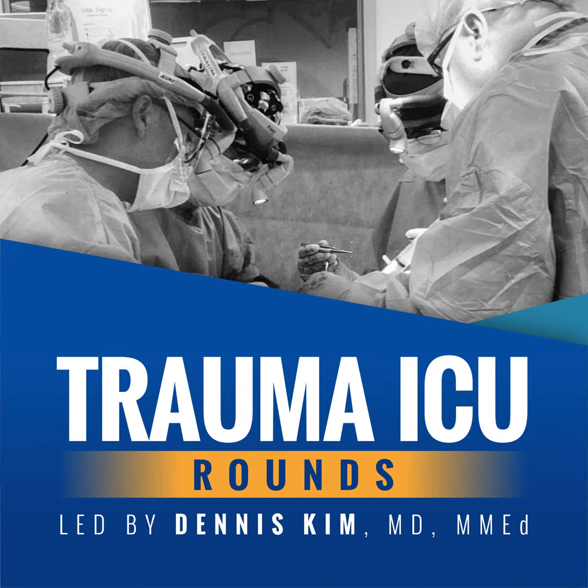Finally, a couple of other considerations that do come up are, number one, what's the potential difficulty in terms of reintubation? And that kind of gets back to when we were talking about post-extubation stridor, but we certainly want to risk stratify particular patients in terms of the risk for reintubation or difficulty of reintubation. And then the other issue that does come up is, is there an ideal time to extubate patients?